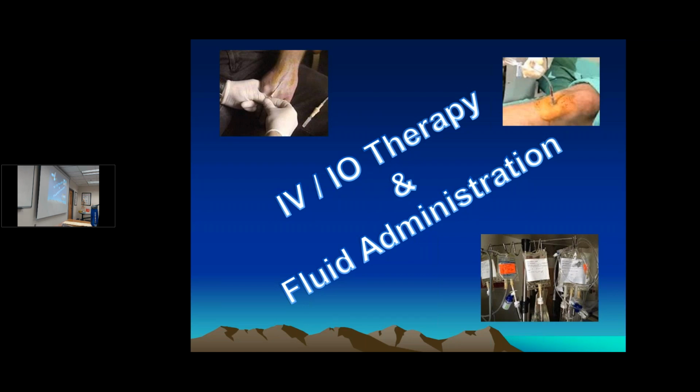You need to understand the applications down the road. What do you mean? Well, for CVA cases, if you're not going to use a 16 or a 14 gauge needle, then usually they just have to put it in a different IV access for that. Okay. What else? You're right. What else? Sugar considerations.